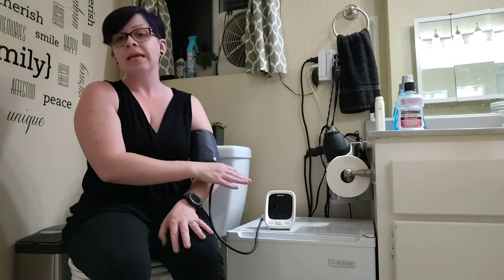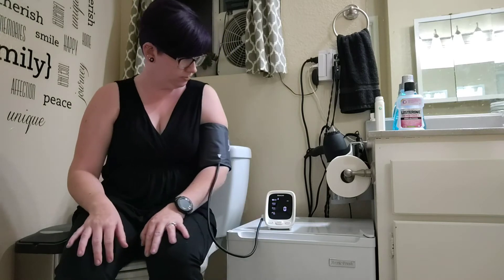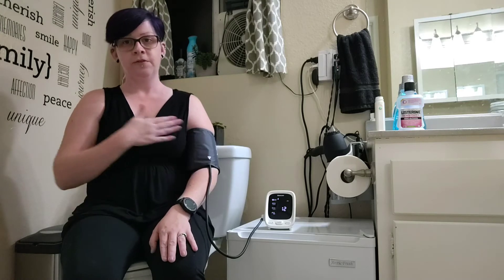Then I hit start and it's going to walk me through taking it with reminders on how to properly sit. The machine says: 'Please refrain from talking during measurement and keep the cuff at your heart level.'